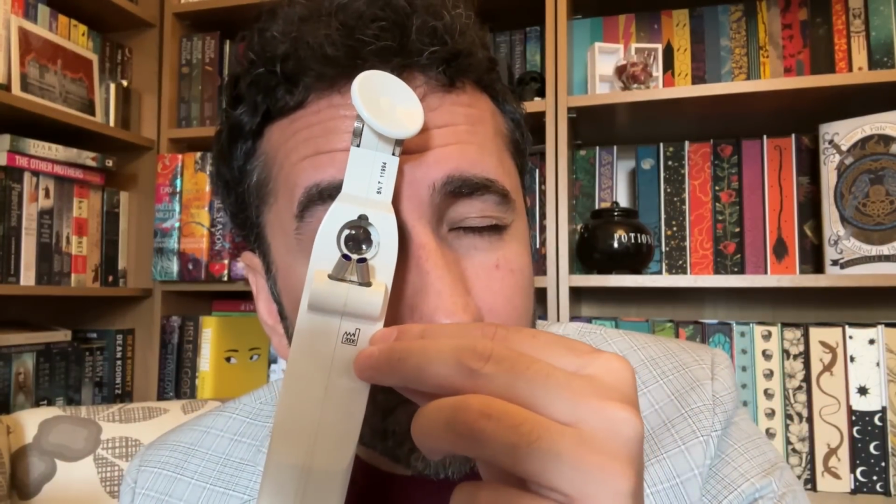We have a device here, which I have showed you quite a few times in quite a few videos. This is a device used for checking intraocular pressure, contact method. Have a little look at this device. Tell me what this is called. What is the name given to that particular tonometry machine?